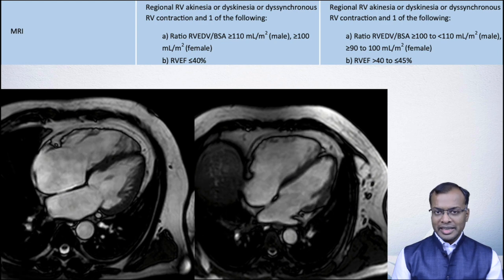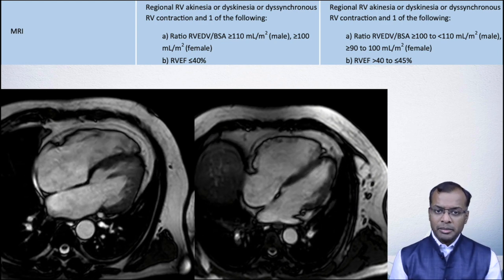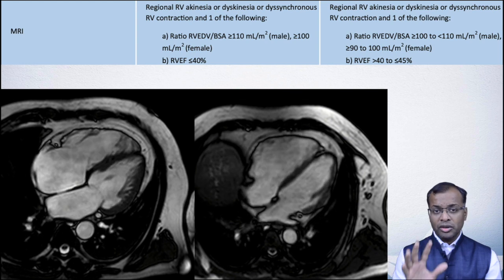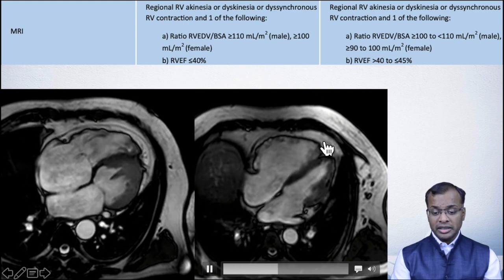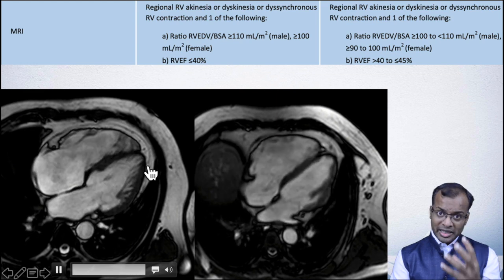Let's look at some of the cases, and let's try and see how one would analyze a cardiac MR study. So this is a cardiac MR study where you can see the four-chamber view and you can look at the contraction of the heart. What is important is to look at the right ventricular free wall, which you can see across here, and see how it contracts. The left ventricle seems to be contracting really well.